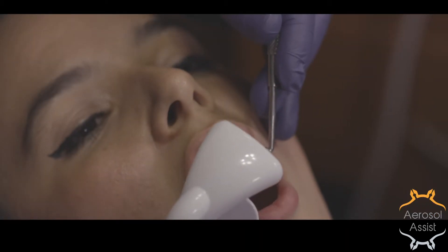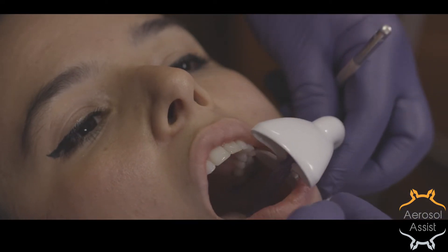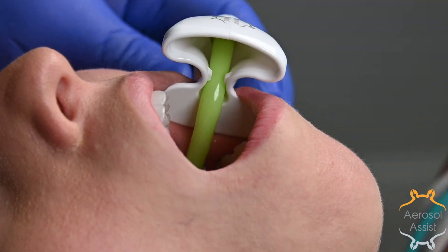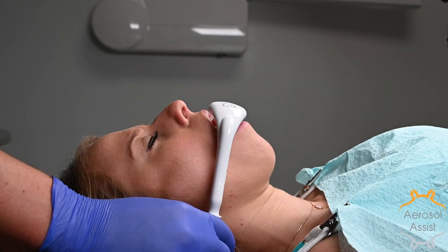When installed correctly, it can be moved from one side to the other with minimal alterations. The following are different angulations of a properly installed aerosol assist. Notice the lack of tension visualized on the hose and patient's cheeks.